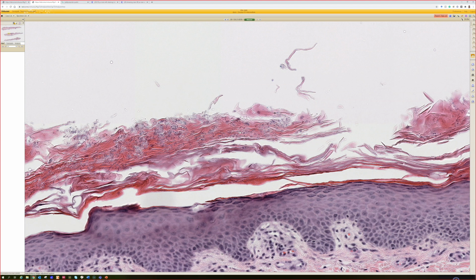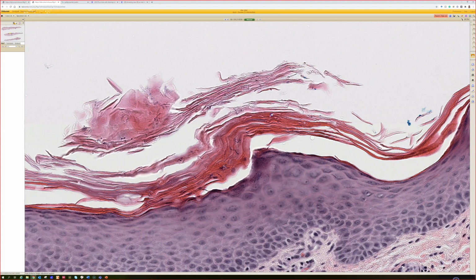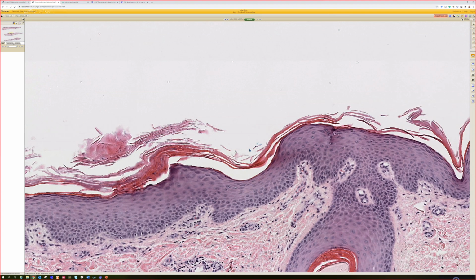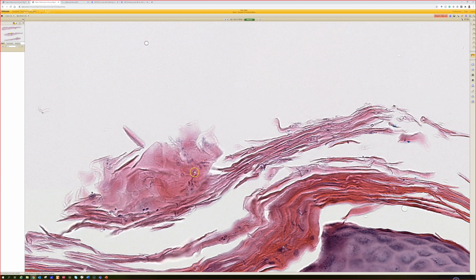But when they start producing hyphae, once you get not just the meatballs but the spaghetti, that's when you know it's probably a spreading eruption or a spreading infection that's actually Tinea versicolor, or pityriasis versicolor as some people like to call it, because it's not actually dermatophyte fungus and not Tinea. I feel like the spaghetti and meatball appearance is best seen on a skin scraping, KOH preparation, but you can sometimes see it in areas where you get thicker keratin, because the keratin kind of comes loose and flips, and what we're seeing there is the equivalent of a KOH preparation, and you can see little hyphal structures and the little yeast forms.